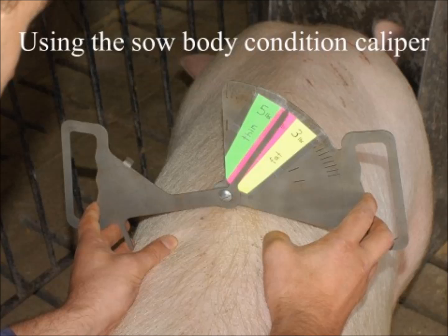Hi, my name is Dr. Mark Knauer at North Carolina State University, and today we're going to be talking about using the sow body condition caliper.